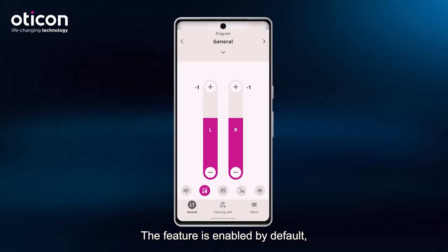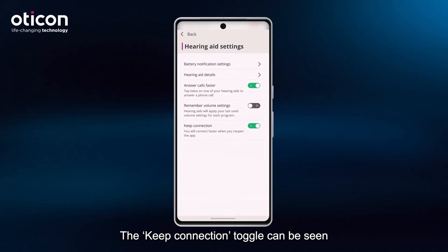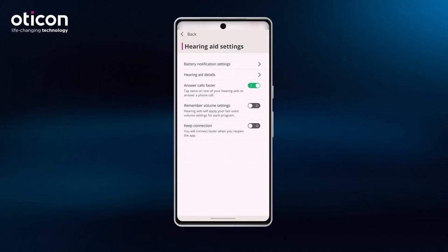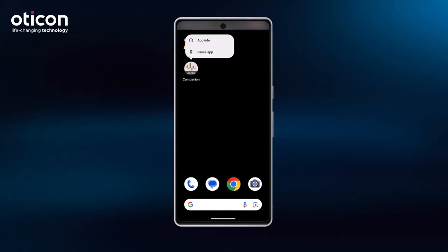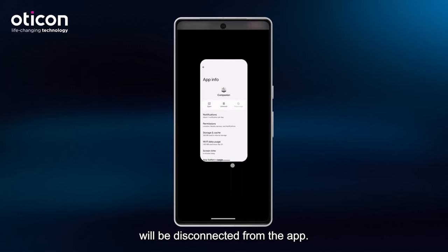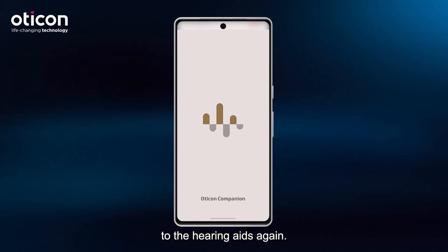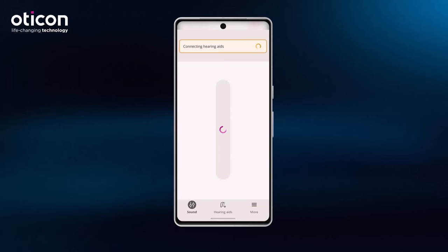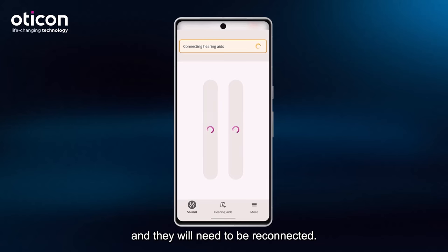The feature is enabled by default, but can be disabled by tapping on Hearing Aids, then Hearing Aid Settings. The Keep Connection toggle can be seen at the bottom of the screen. If the user force stops the app, then the hearing aids will be disconnected from the app, and the next time the app is launched, it will need to reconnect to the hearing aids again. Note that if the app is swiped away during a remote fitting session, then the hearing aids will lose connection to the app and they will need to be reconnected.